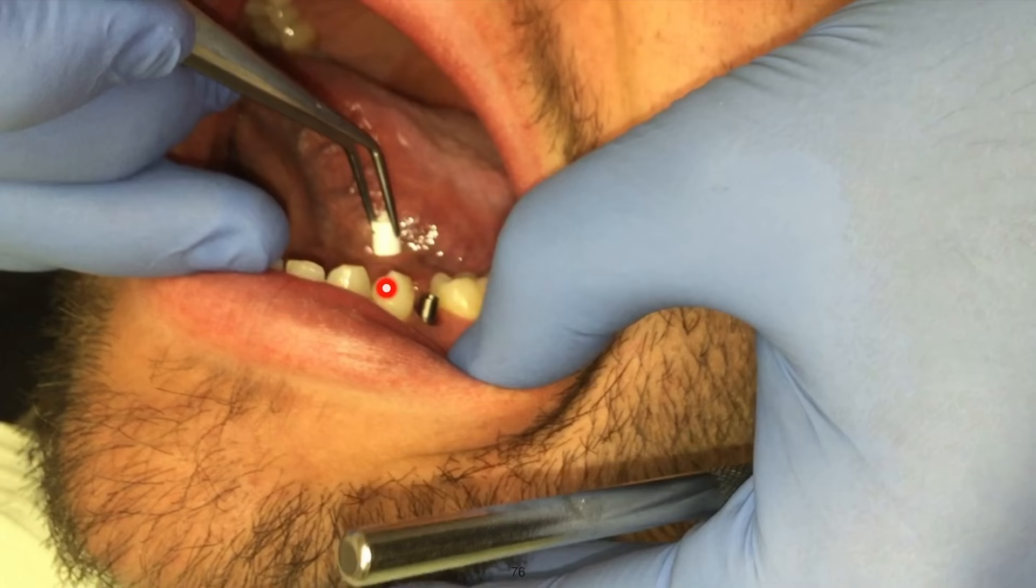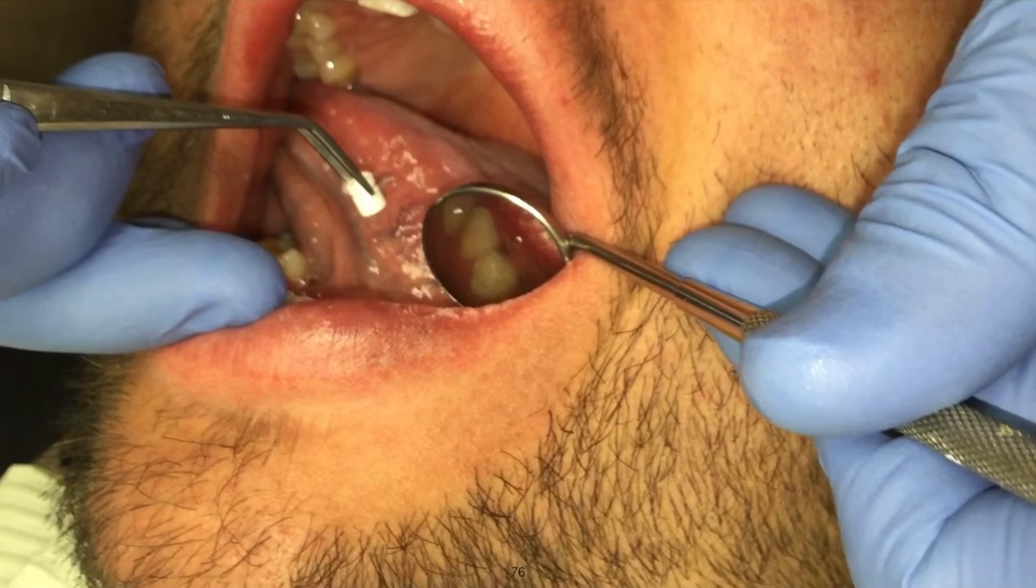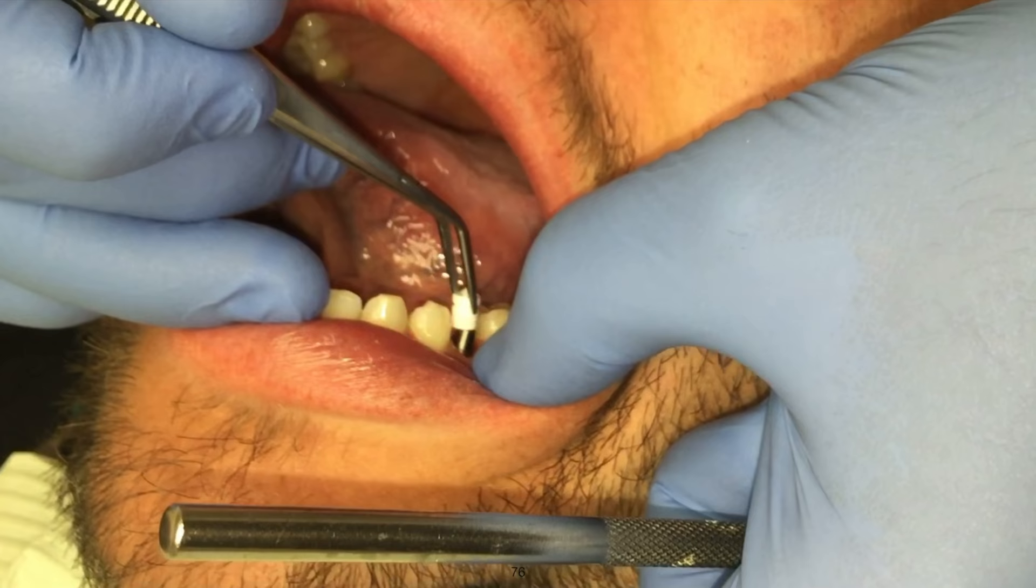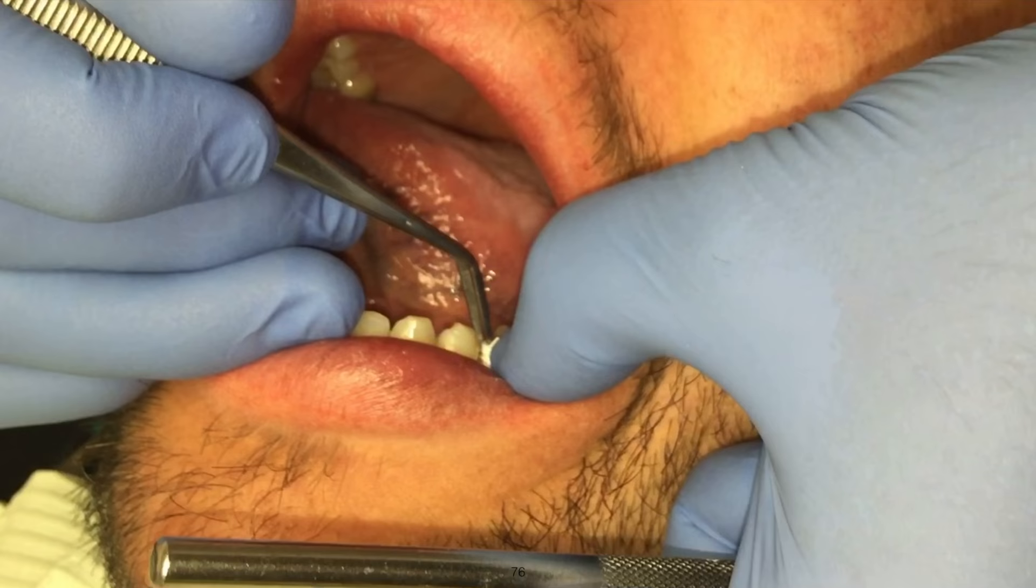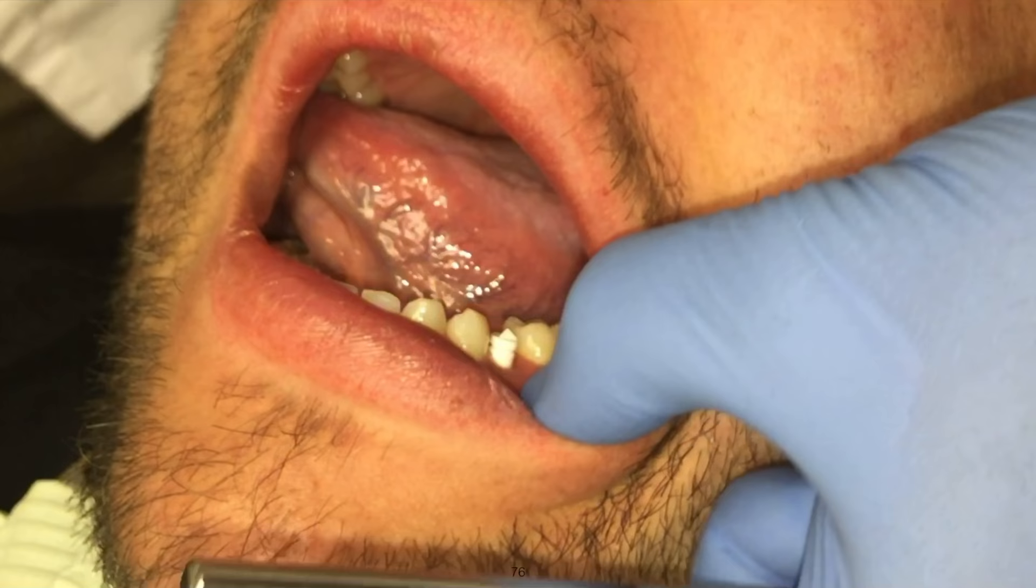Here comes the scan body. This is a white one. The white generally is used for the BlueCam, however the Omnicam reads it just fine. What I'm looking for there is where is that internal index, the notch and the groove. I'm trying to line that up appropriately to make sure they slide together. You can see there I've found it and they slid right in. I'm just double checking it's seated all the way.